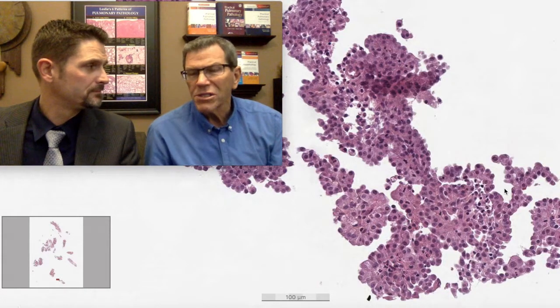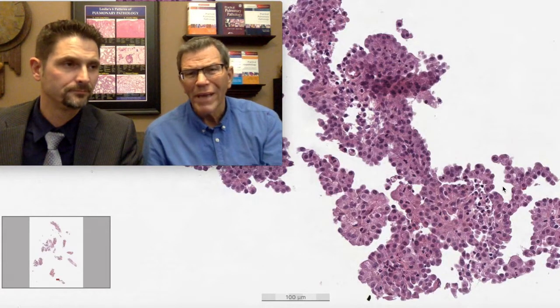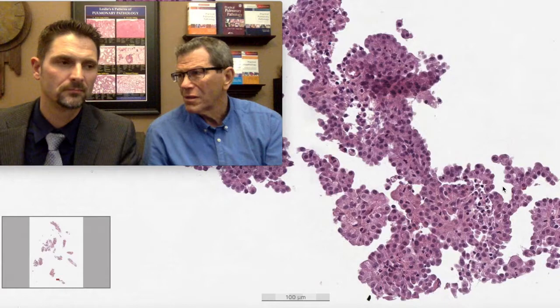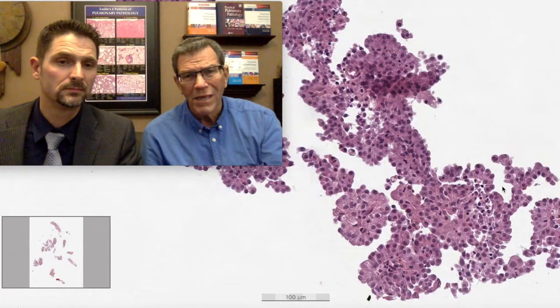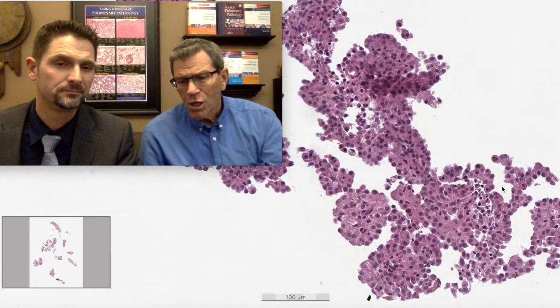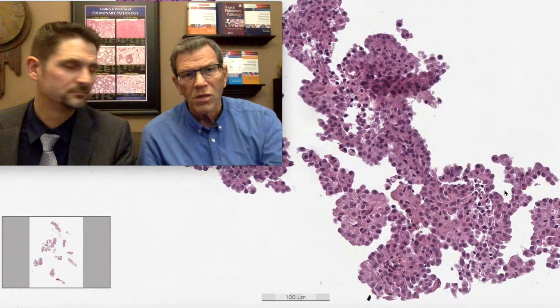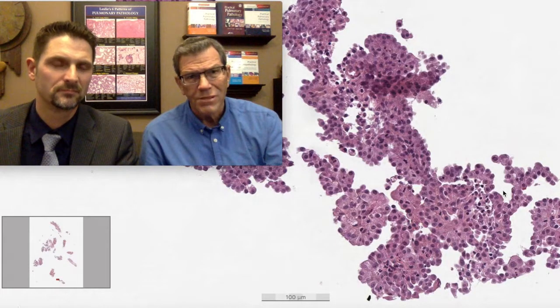I would say especially if your epithelial markers, particularly adenocarcinoma markers, are negative and you're struggling with a diagnosis of mesothelioma. Remember, mesothelioma is a universally fatal disease that doesn't have current successful treatment. So if the stains aren't lining up, why would you want to be the first one to diagnose that without substantial evidence? The patient's disease will continue to progress, and the least of his or her problems will be that they have to rebiopsy at some future date.